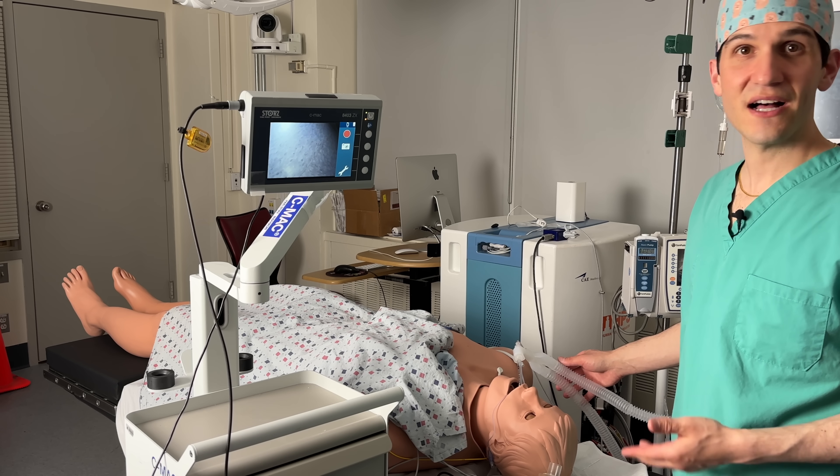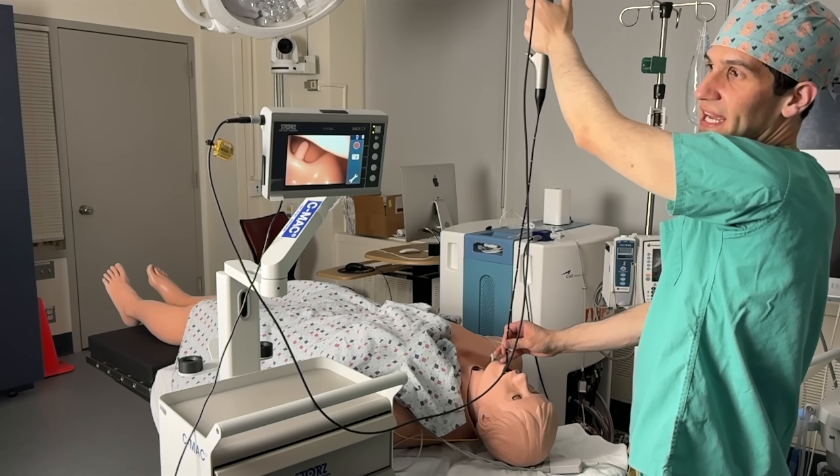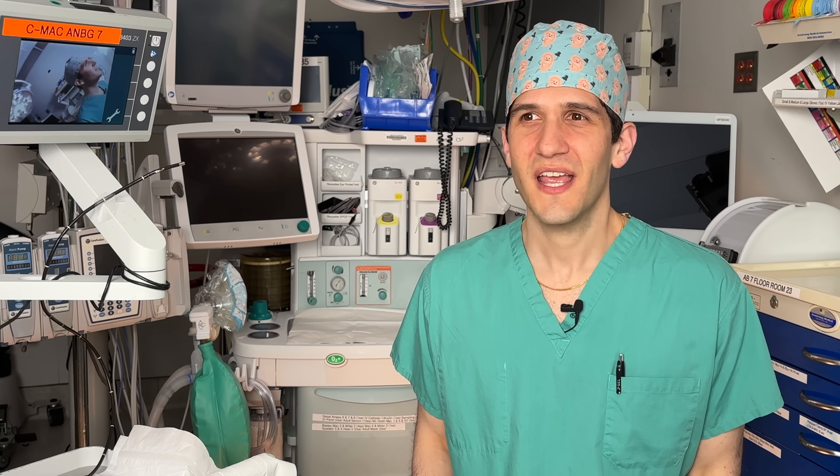Now that I've got the endotracheal tube in place, I'll administer anesthesia so that we can get started with the surgery. As with many aspects of medicine, practicing fiber optic technique is the way to perfect it. But practicing on an awake patient is not typically a very kind thing to do, so looking for alternative options can be really helpful. If you have access to a simulation mannequin, that can be a really great strategy for getting comfortable with the scope. There are also simulators that turn a fiber optic scope into a video game — there's one that has you bopping gophers in holes. Starting out with the gopher game is definitely better than starting out on an awake person. It's really important to read about all of the key anatomy and physiology before you get started. One resource I'd recommend is from NYSORA — I've put a link that you can check out for more information.